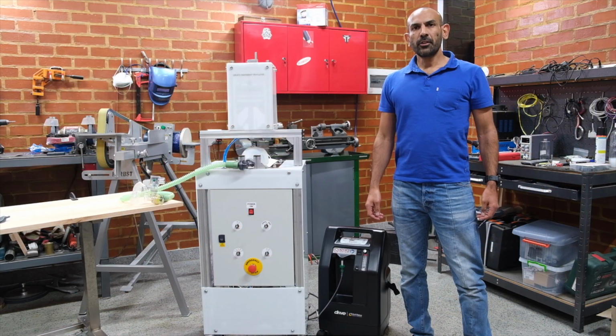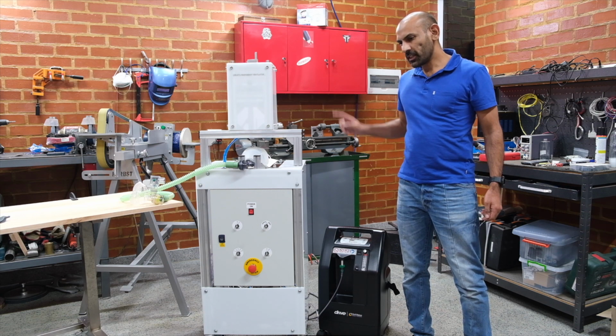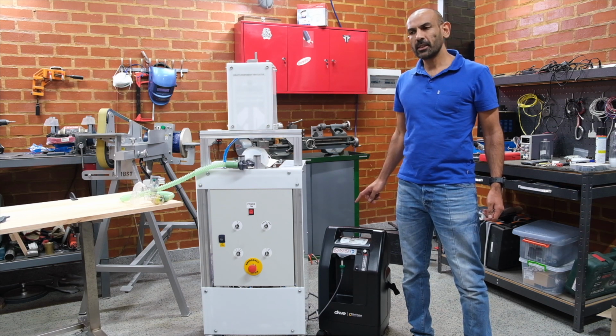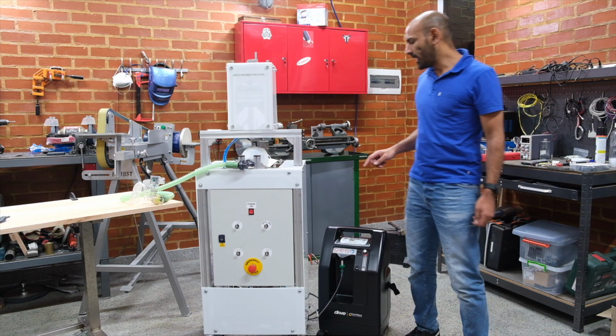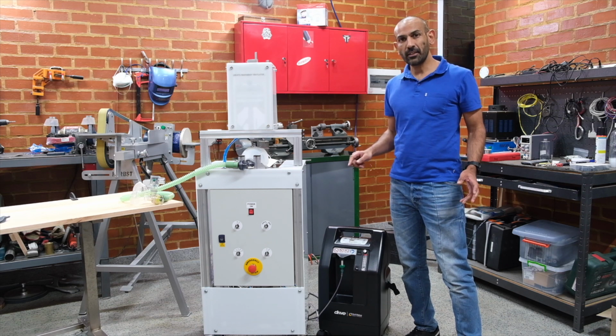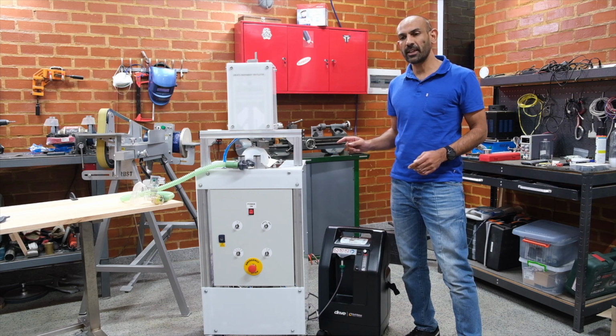Now I'm going to take you through how the machine is connected. Currently, this machine is connected to an oxygen concentrator. But in the field, it's more than likely that this will be connected to an oxygen tank. From the oxygen tank, air is supplied, and this is another feature of the machine, it's supplied via a valve, and that valve only opens on the inhalation cycle to conserve oxygen.